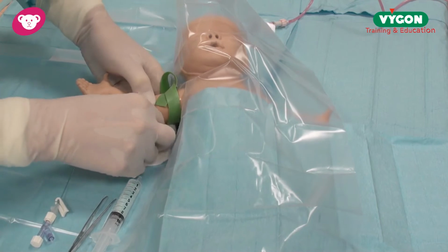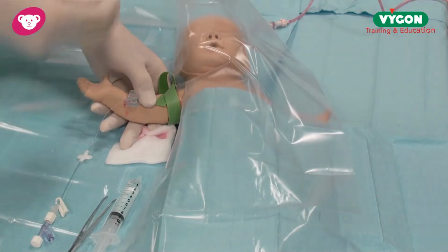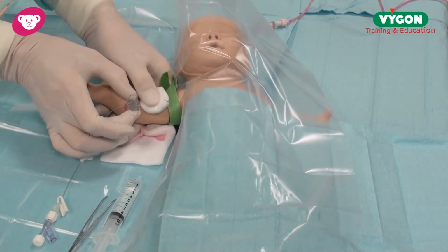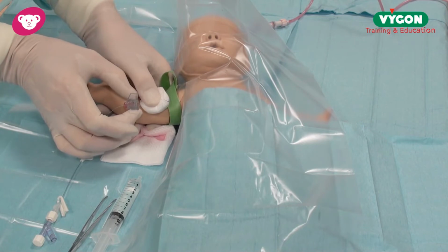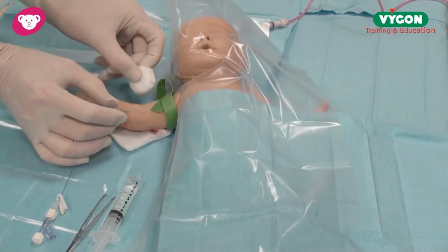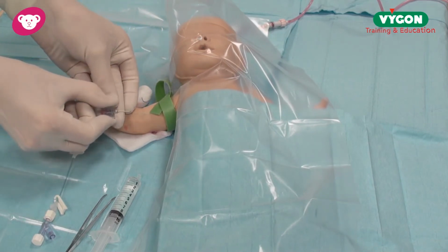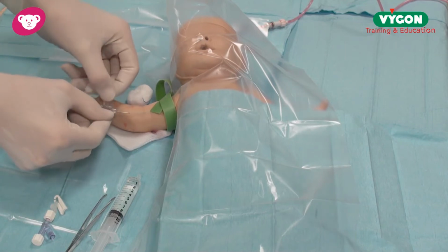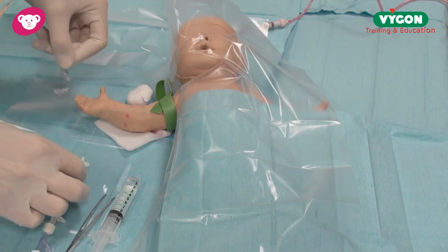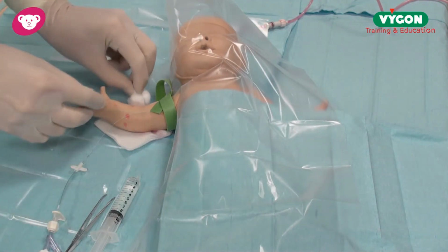I make sure that I hold the needle in place with a sterile swab. Bring the needle out of the baby very carefully, not to disturb the catheter. Support the needle, and now break the needle and peel away like so, and lift the catheter out of the needle, and then dispose of the needle into your sharps bin.